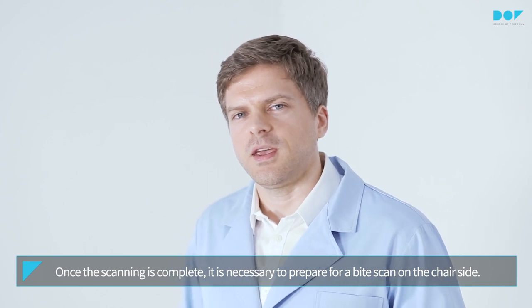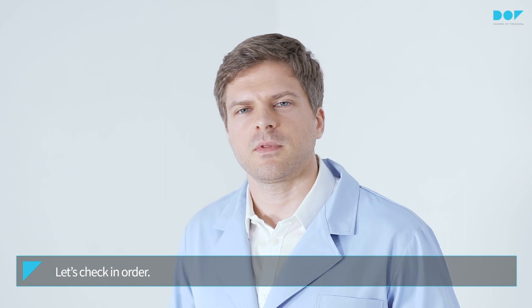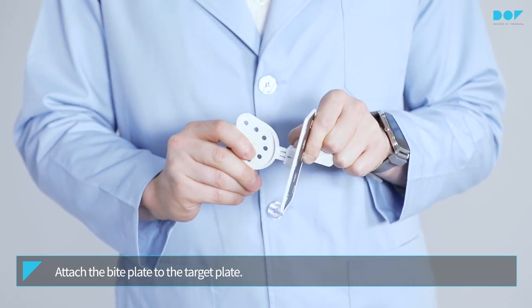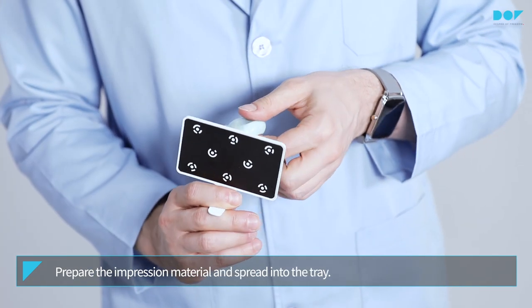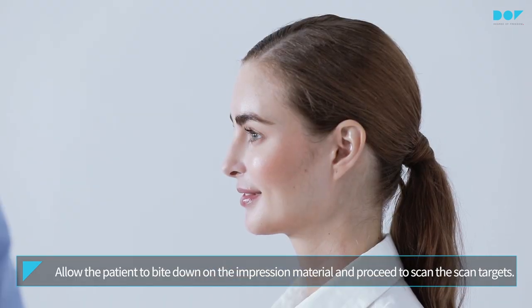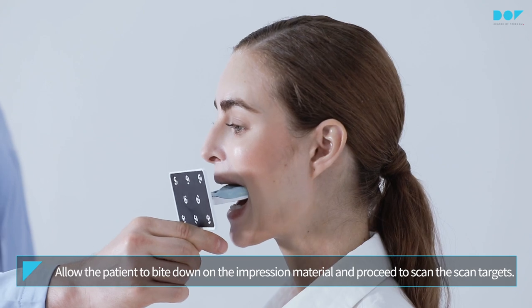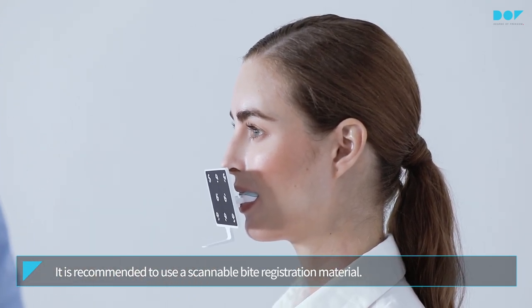Once the scanning is complete, it is necessary to prepare for a bite scan on the chair side. Let's check an order. Attach the bite plate to the target plate. Prepare the impression material and spread it into the tray. Allow the patient to bite down on the impression material and proceed to scan the scan targets.